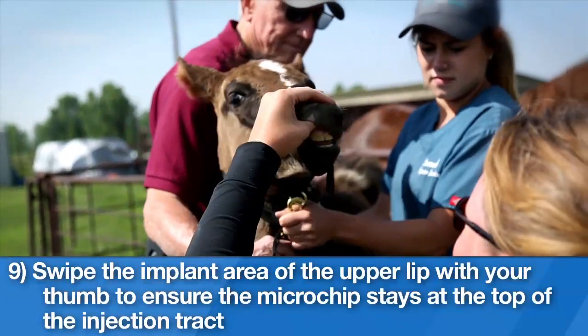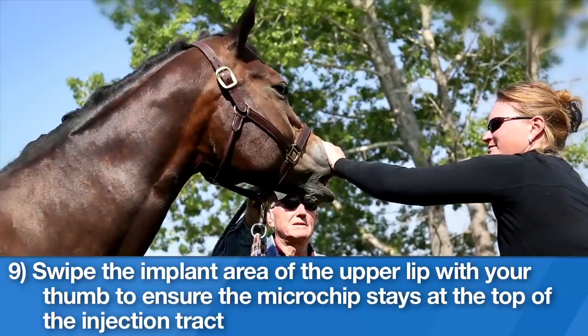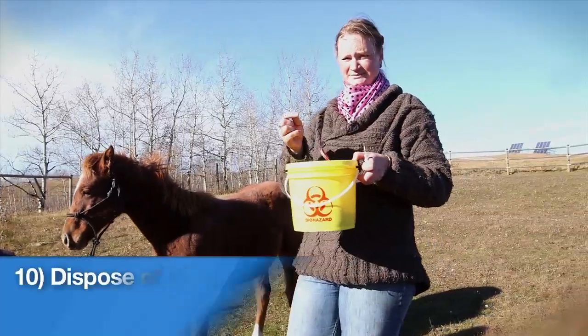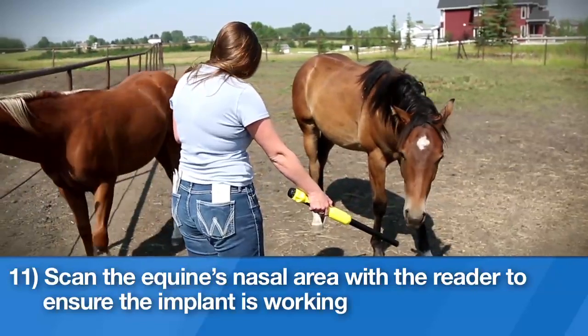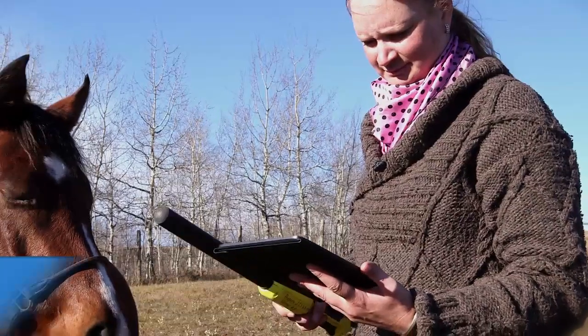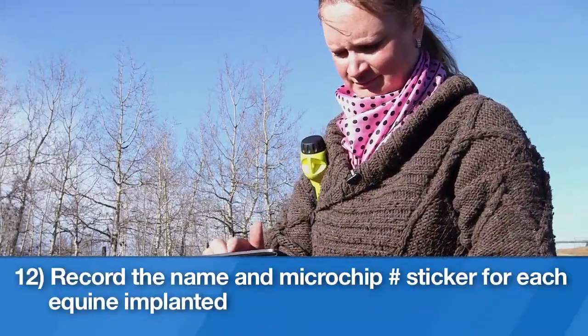9. Swipe the implant area of the upper lip with your thumb to ensure the microchip stays at the top of the injection tract. 10. Dispose of sharps safely. 11. Scan the equine's nasal area with the reader to ensure the implant is working. 12. Record the name and microchip number sticker for each equine implanted.